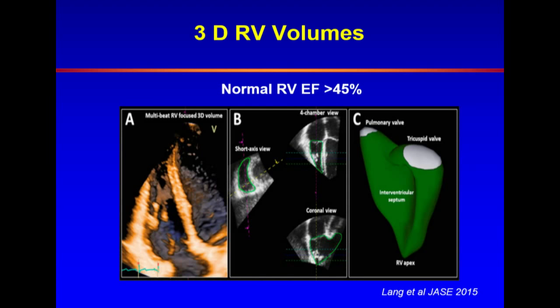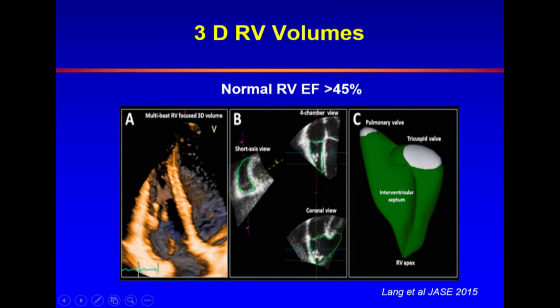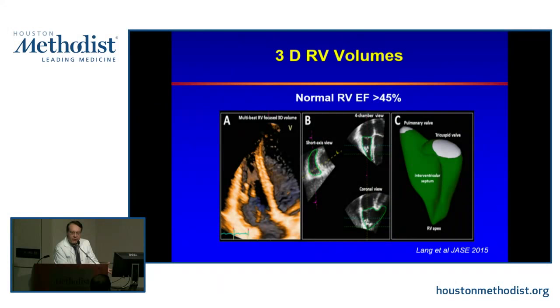Then comes 3D of the right ventricle. 3D of the right ventricle has been validated, or I should say compared against CMR, and has shown acceptable correlations with CMR in terms of values, okay? Again, a lot of the work depends on how you measure things. At the end, when you look at different studies, you have to see what patient populations got you there, what sort of right ventricles. If you have really bad 2D images, it is hard to imagine that 3D will make something better.